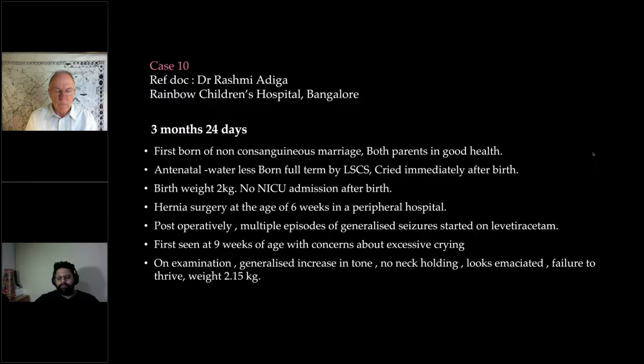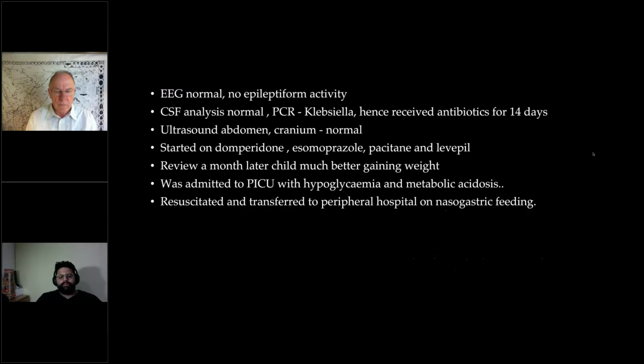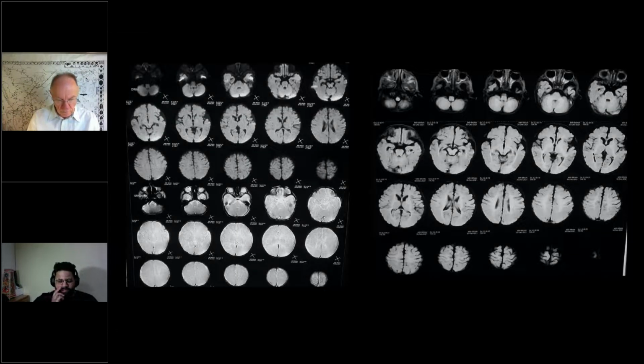Okay, that's helpful because at least we know that with the MRI, there is no hypoxic injury. So I can tell them that there is no hypoxic injury. I would say that the imaging handle is pretty weak for this case. Okay, that is my conclusion. But no definite changes of hypoxic injury, at least the hypoxia related change at 6 weeks post birth.